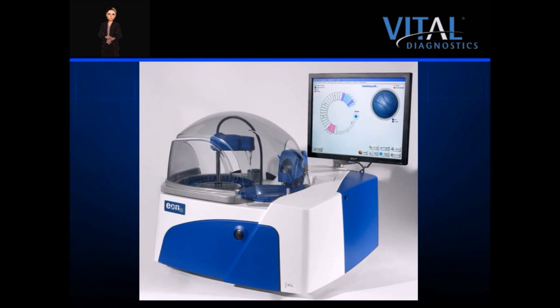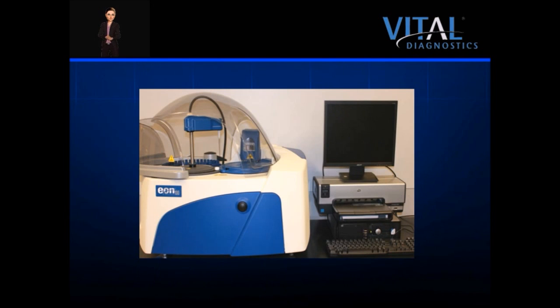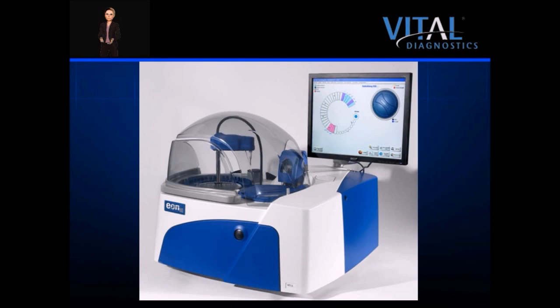The EON100 is a benchtop chemistry analyzer featuring a compact footprint that easily fits on any standard countertop. The analyzer measures 31 inches in height with the monitor on board. The monitor is removable and can be placed on a bench, reducing the instrument to 25.5 inches. A few inches of clearance above the analyzer is recommended for easy serviceability.